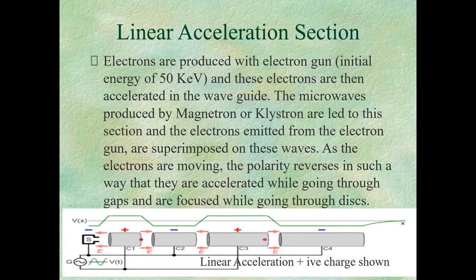Remember here, we had primary collimators and then we had secondary collimators. We can have tertiary collimators and accessory mount. So we are going to discuss this section in detail one by one.